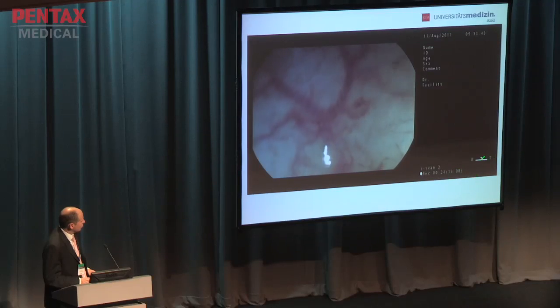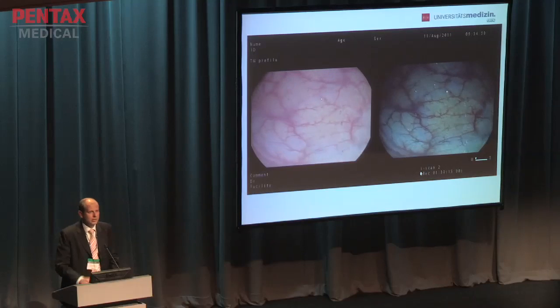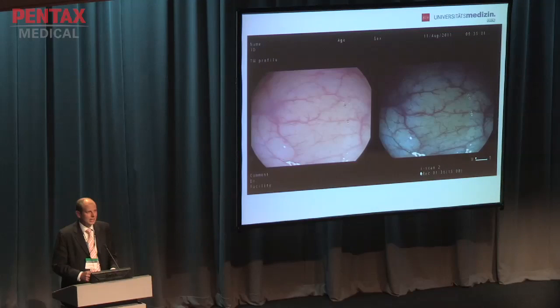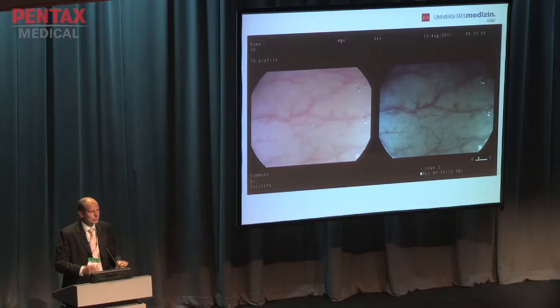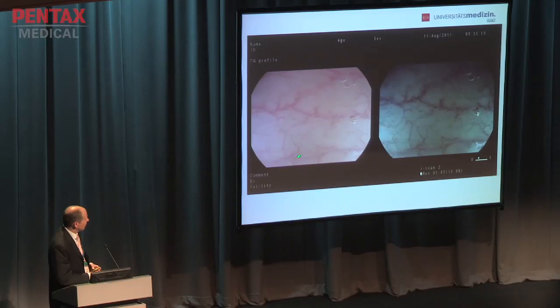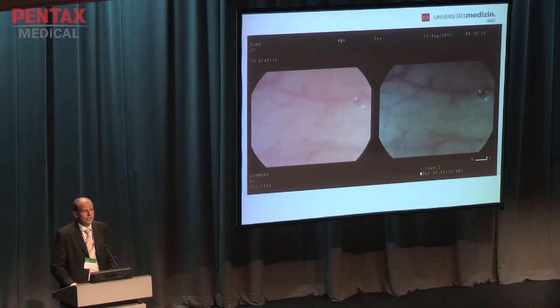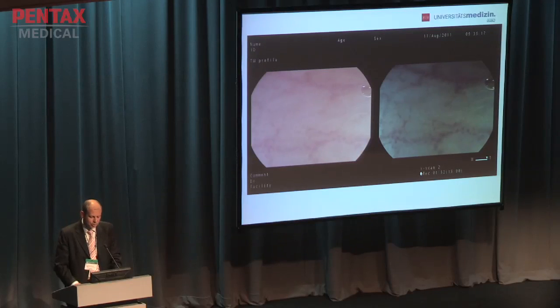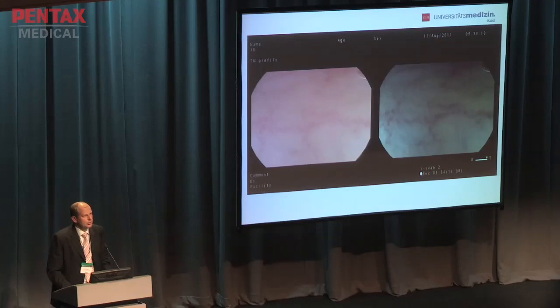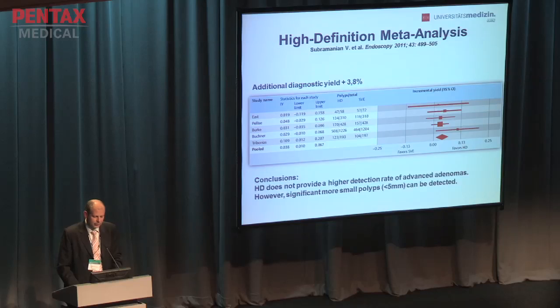You see here that you also have the possibility to do zoom endoscopy, but sometimes you get frustrated because you are not sure whether this enhanced image truly shows something which is of value, and that's why you have this twin mode where you see all the time your white light endoscopic image, then you have here your enhanced image, so you can compare all the time what is relevant or not, and I think that's a substantial improvement and advantage compared to the NBI system, which you can only switch on and off. Here you have the direct comparison in high definition.